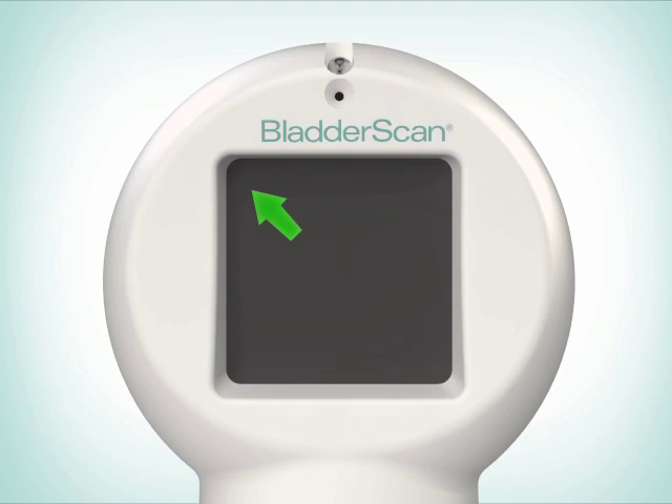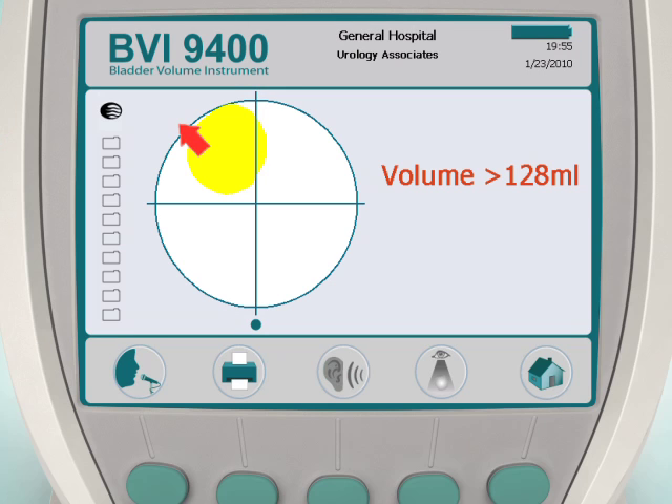A solid arrow means you are slightly off target. A flashing arrow means you are significantly off target. Console crosshairs will confirm if the probe is off target, and an arrow will point in the direction of the bladder.